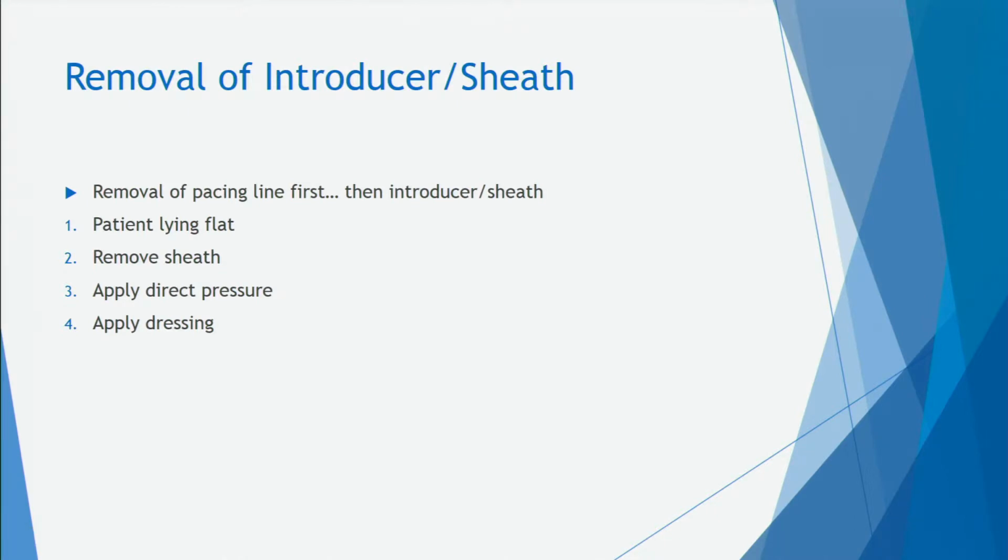Right. And they may come out with this still in place, but I guess at this point the doctor would probably remove them. This is what a traditional cordis looks like. You can see how extremely huge that is. But if y'all want to come look up close, this one's smaller. This is more like just a central line.